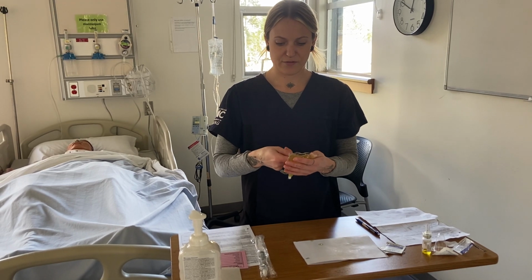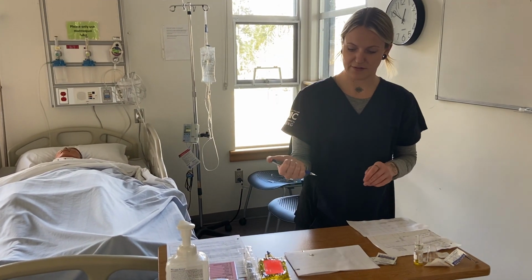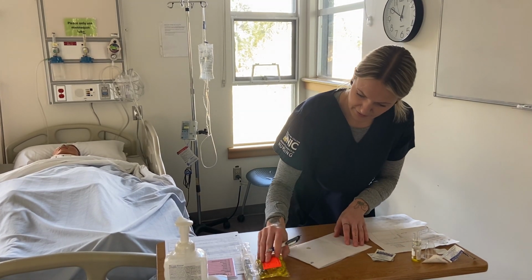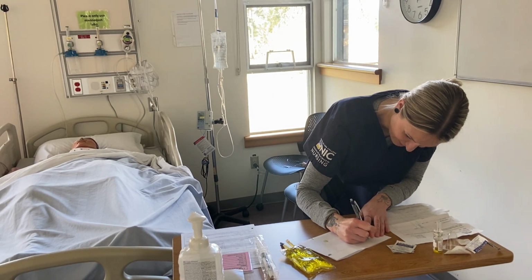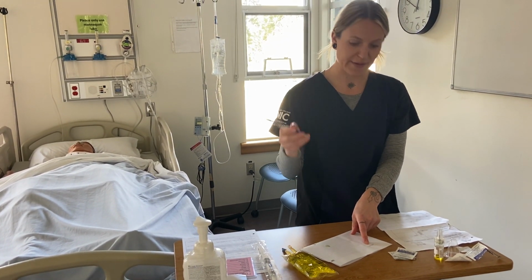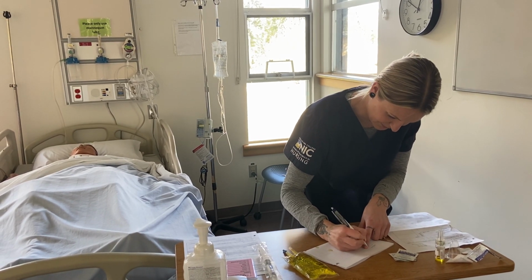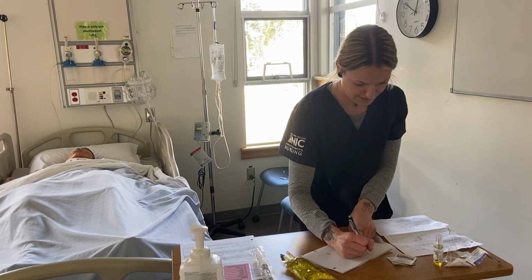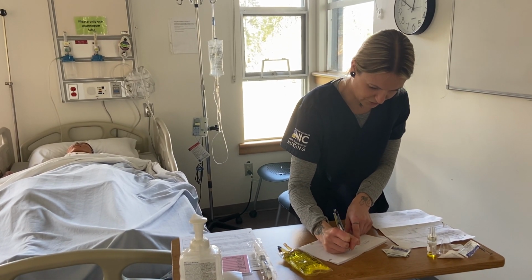All right, so because I'm not using a pump, I have to calculate the drip rate, so I'll do that by however many mils are in my mini bag, so 100 mils. And I am to infuse this for 20 minutes, so divided by 20 minutes times my drop factor, which was 10, equals 50 drops a minute.